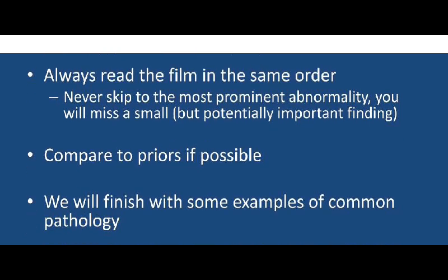Now, make sure you're always comparing this to the prior examination if possible. That is why, when a patient has done a radiograph, the X-ray images are stored in the department, especially for an examination that needs follow-up, so that you can check the previous one against the recent one to know whether there is any development, whether there is any improvement, or whether it's getting worse. So that is why we actually compare these things.